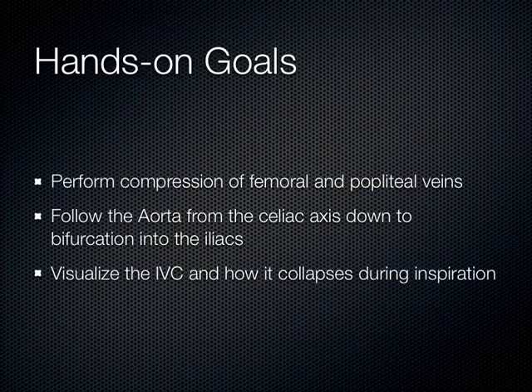Okay. So today, with the hands-on session, we're going to do compression of the femoral vein and the popliteal vein. You'll see how fast this goes today. It's going to be a pretty quick scanning session, I think, because you're just compressing the fem area, and then you go down to the pop, and then you're going to follow the aorta down until it bifurcates, and then I want you to look at the IVC and how it collapses during inspiration. That's about it. If you have time left in your group, by all means, scan whatever you want today.